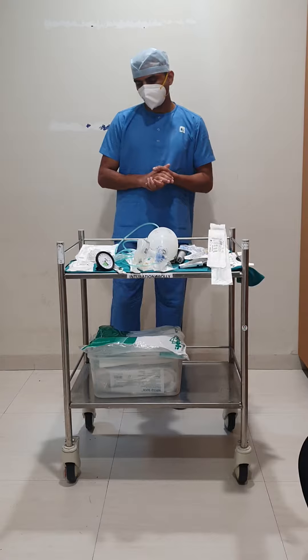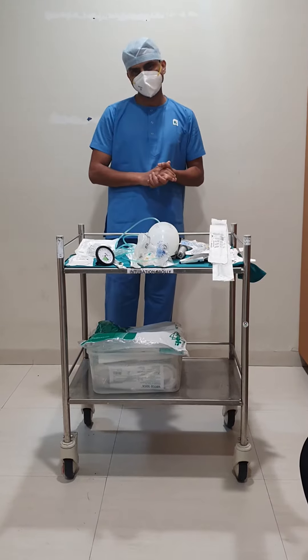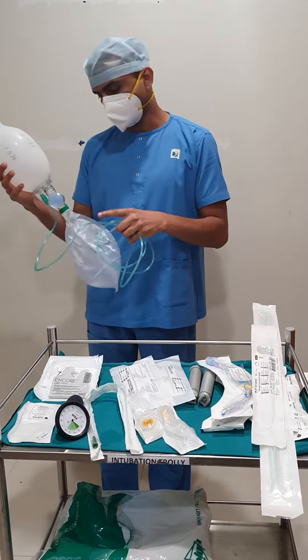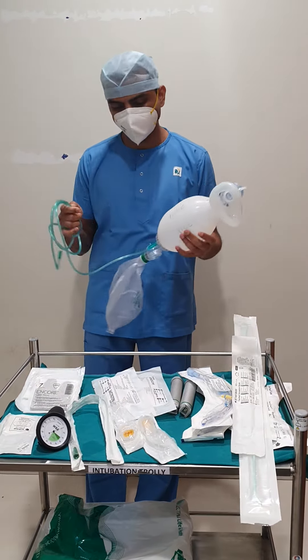Every critical care area will be having a trolley containing these equipment and articles. First, you will require sterile gloves and you will require an ambu bag with mask, reservoir bag, and tubing for providing adequate oxygenation or pre-oxygenation to the patient.